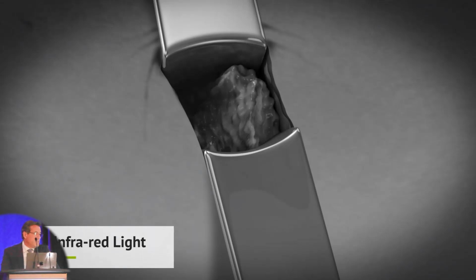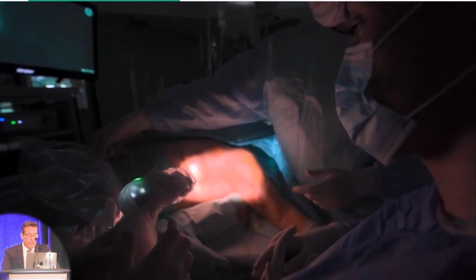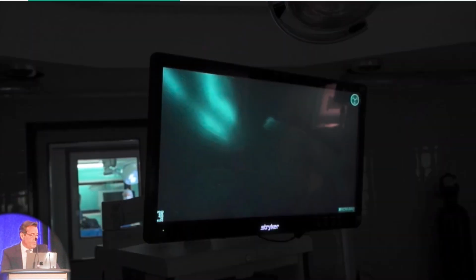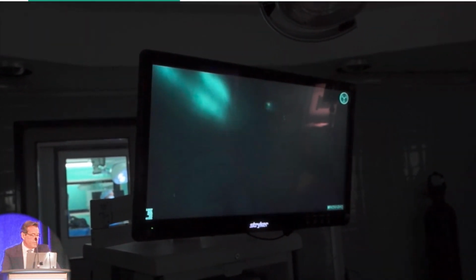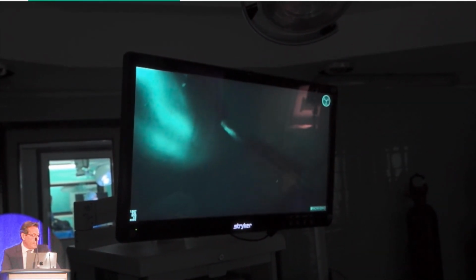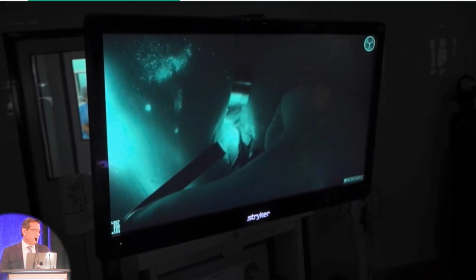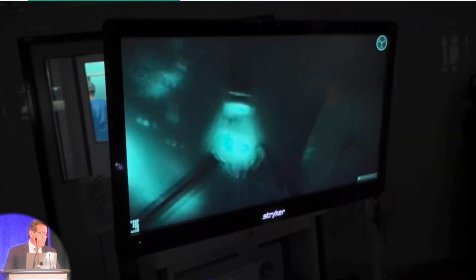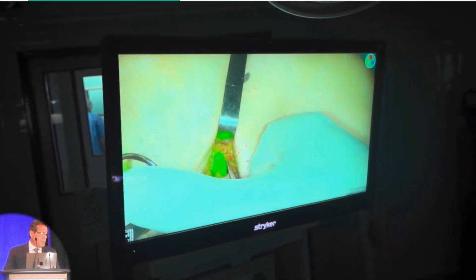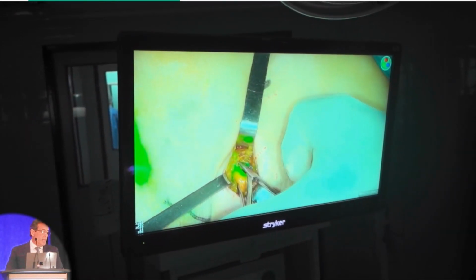This is a video in real time. You see the camera and what happens when you see the lymph channels and they stop, and this is the time when you have to make the incision and look for the Sentinel node. This is with black and white light, and also you are dissecting the lymph node at this moment, as you can see with the overlay mode. You can see the difference between the lymph node and also the fat tissue around the lymph node.